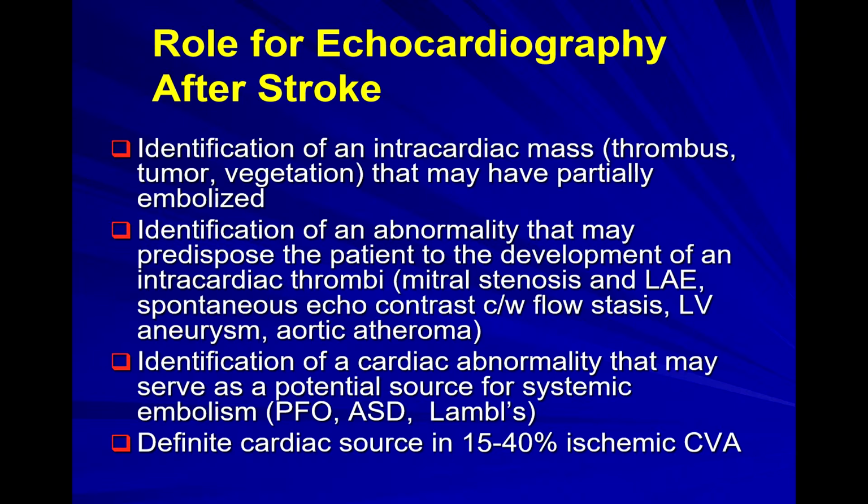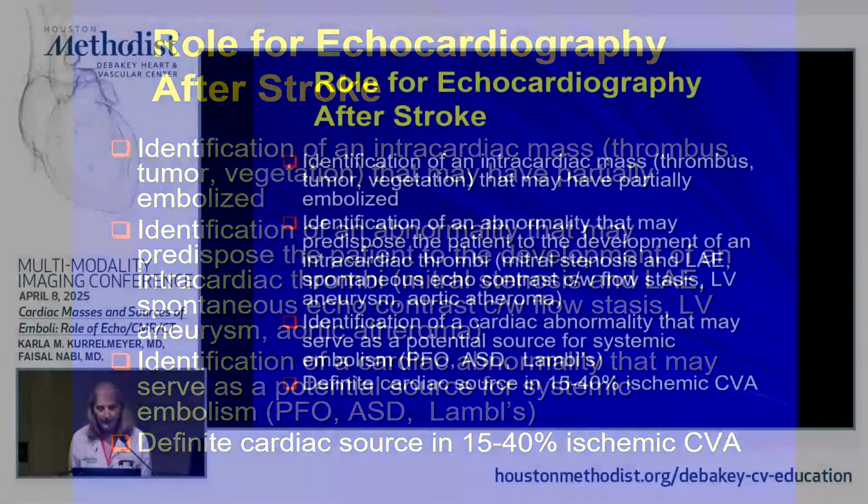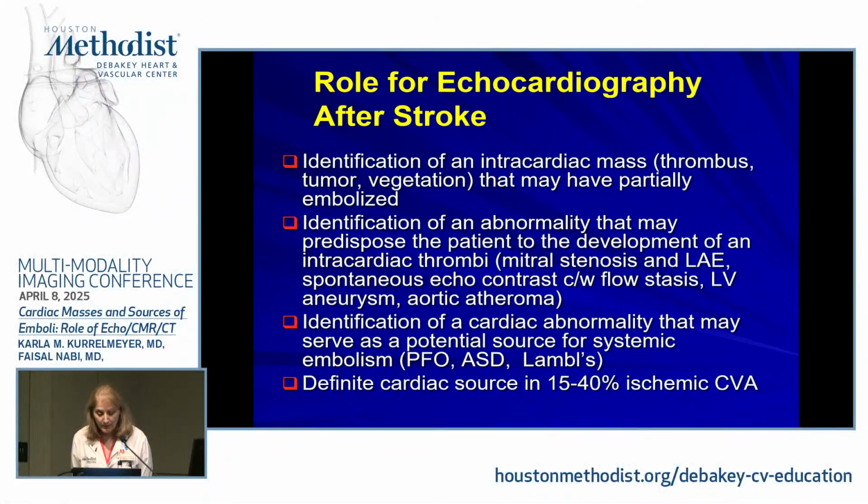Now, is there a role for echocardiography after stroke? Absolutely. It allows the identification of an intracardiac mass, such as a thrombus, tumor, or vegetation that may have partially embolized. It allows identification of abnormality that may predispose the patient to the development of an intracardiac thrombus, such as mitral stenosis, left atrial enlargement, spontaneous echo contrast consistent with flow stasis, LV aneurysm, or aortic atheroma.